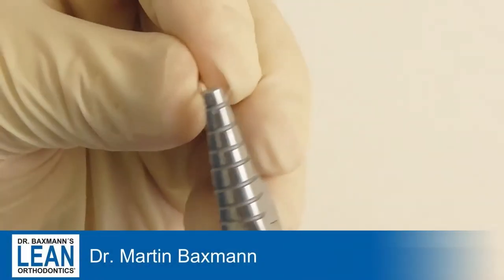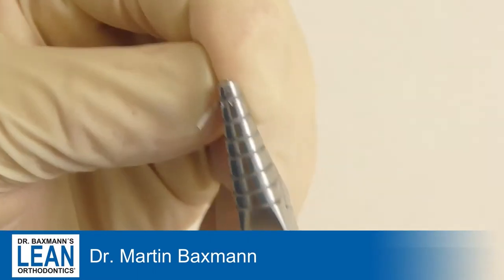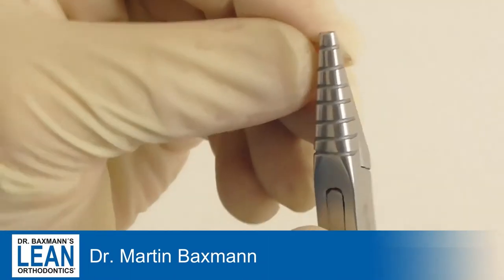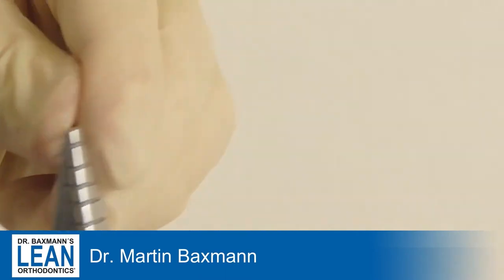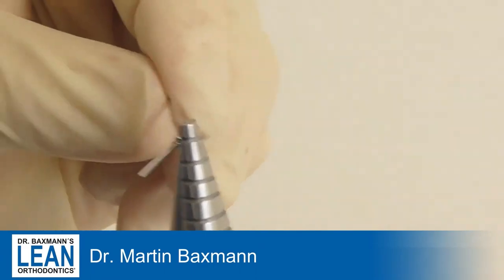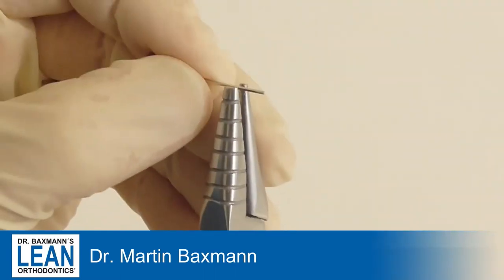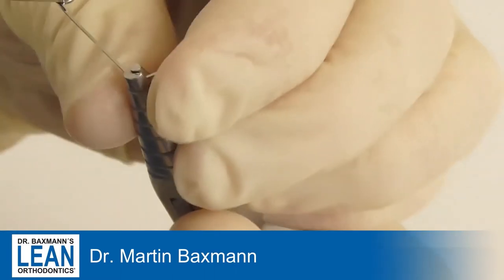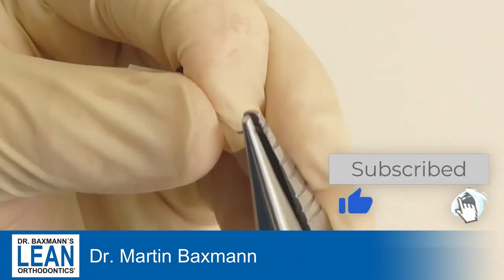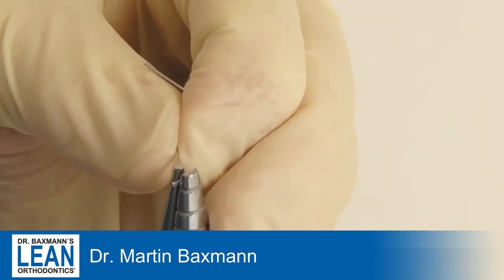To bend the cantilever wire we use a 1725 stainless steel wire and a loop bending plier or something quite similar. We leave a little bit of space of the wire which will go into the slot of a molar tooth and then we bend a double helix. We leave a little bit which will overbridge from the molar to the impacted canine.